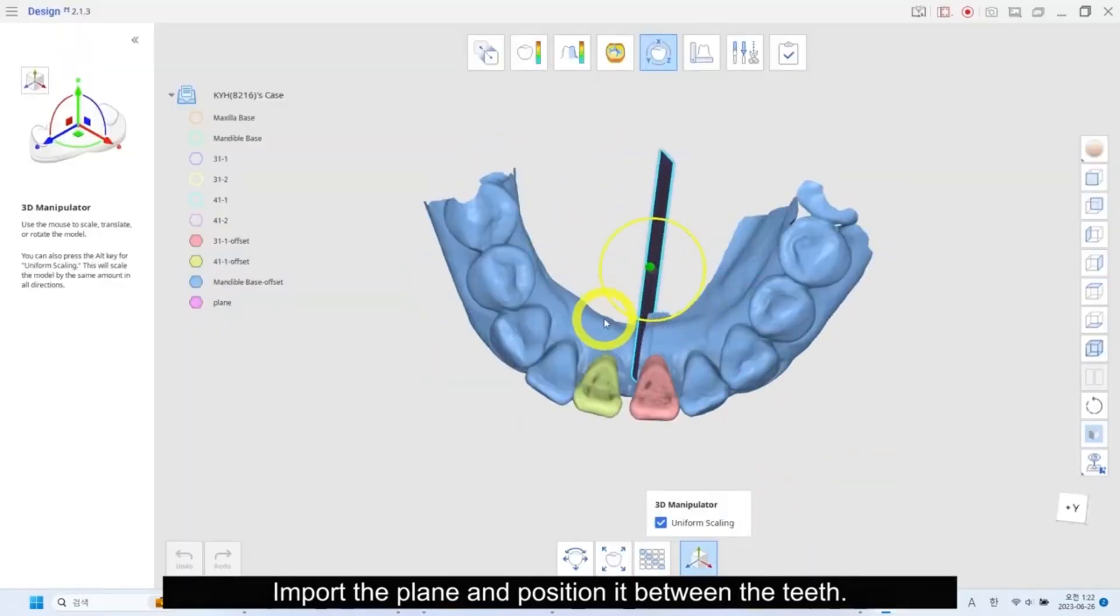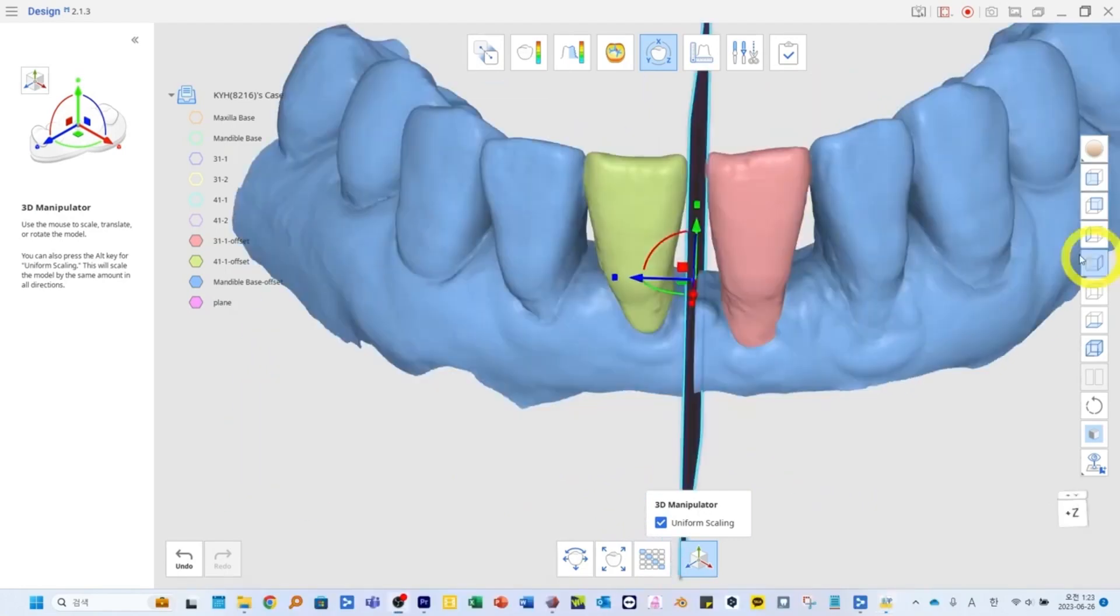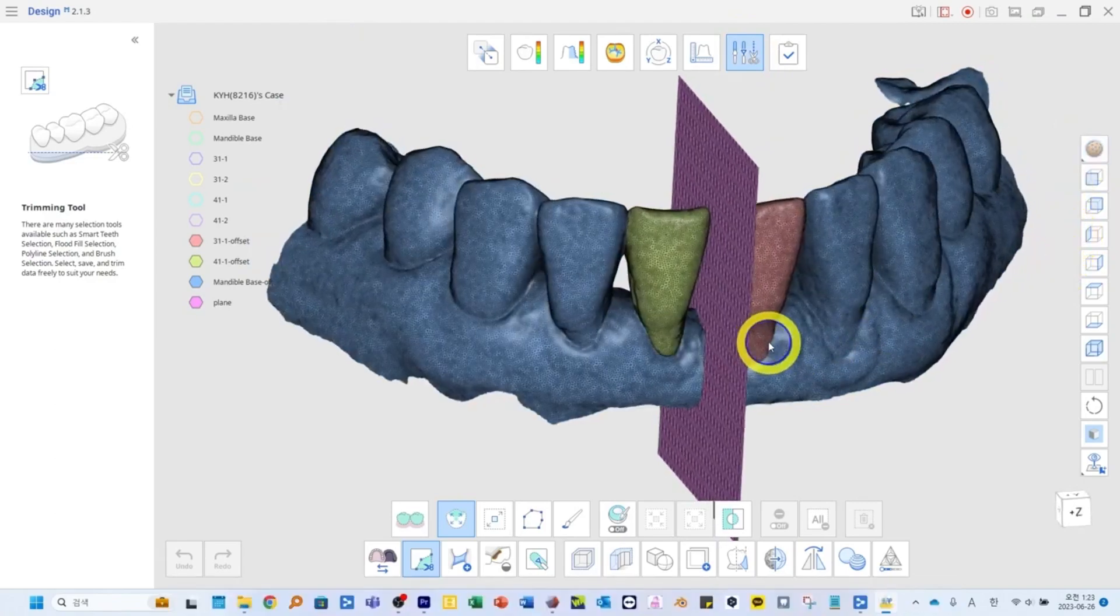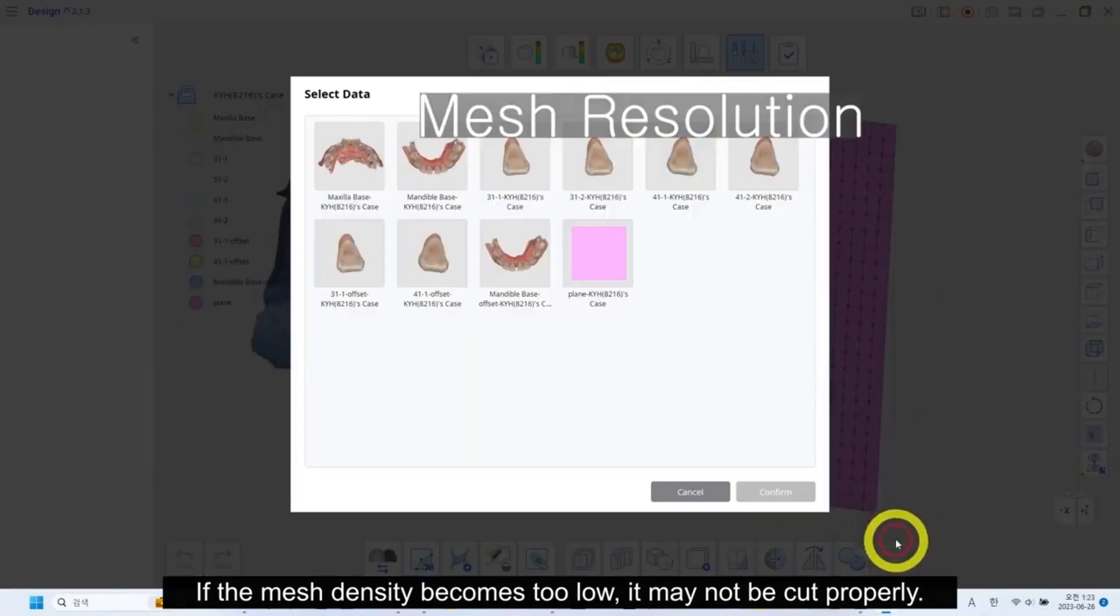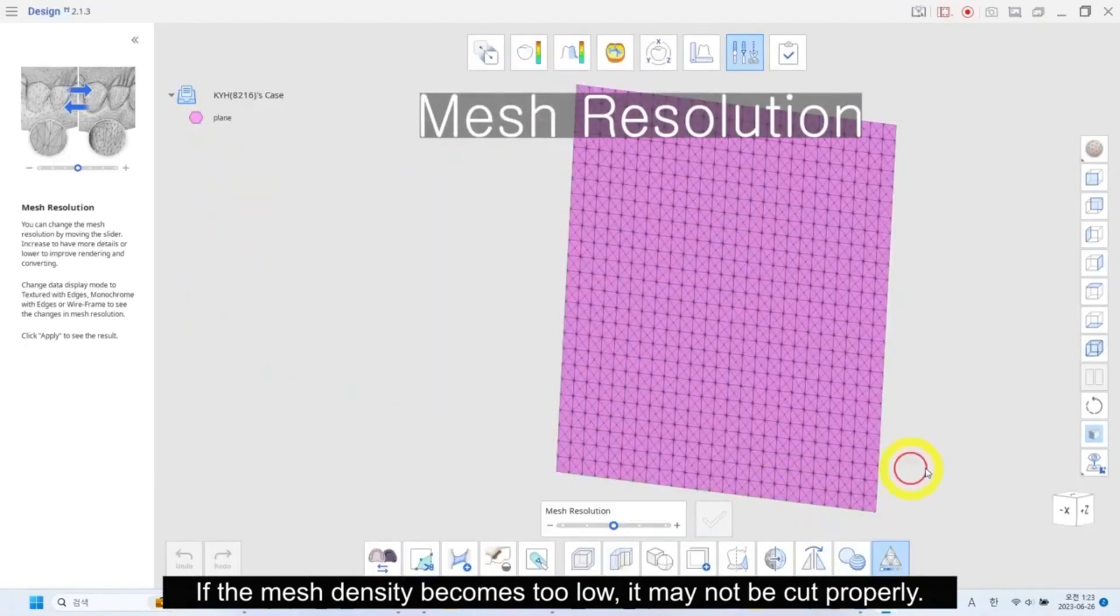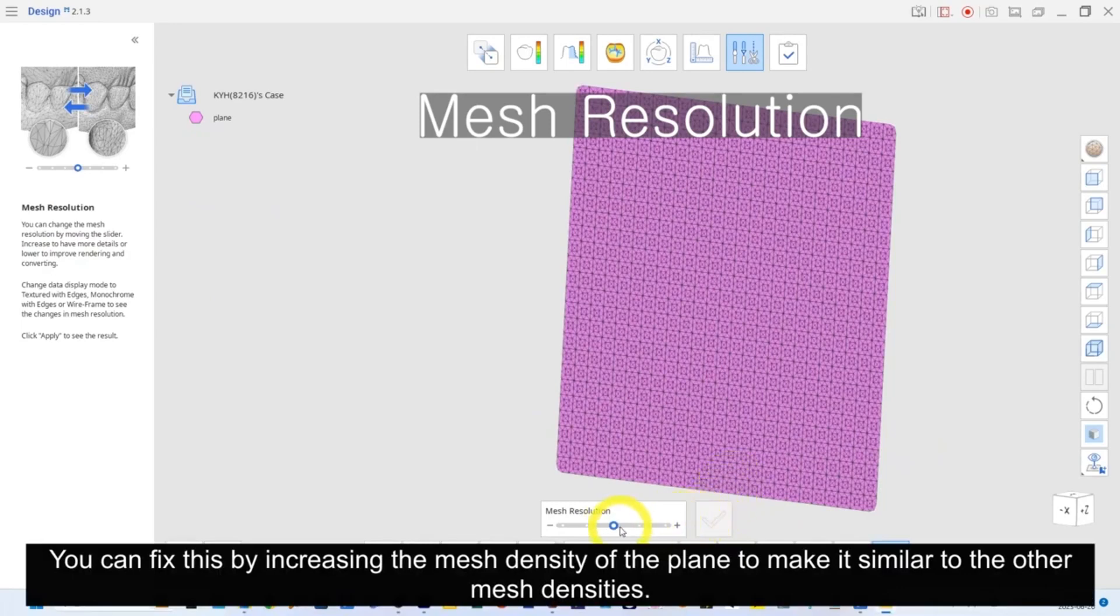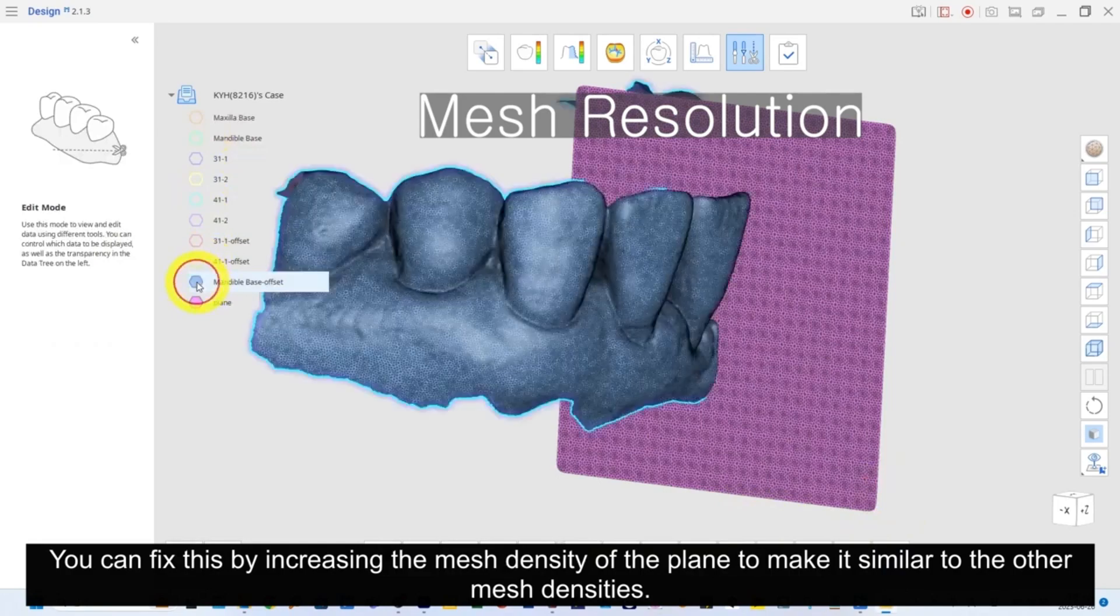Import the plane and position in between the teeth. Depending on the mesh density, the blend result may vary. If the mesh density becomes too low, it may not be cut properly. You can fix this by increasing the mesh density of the plane to make it similar to the other mesh densities.